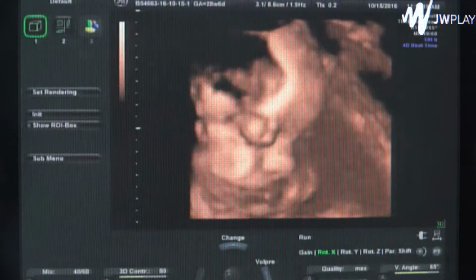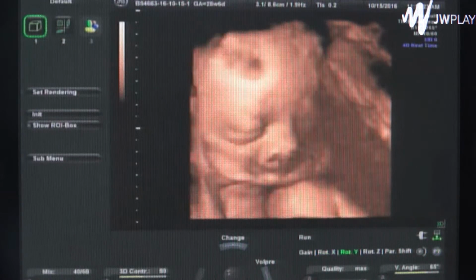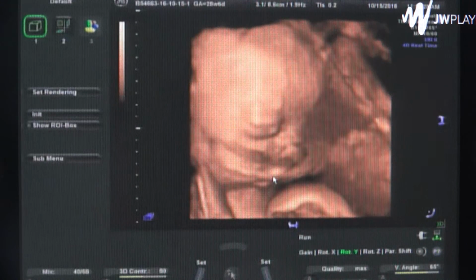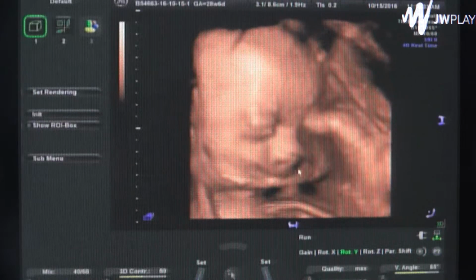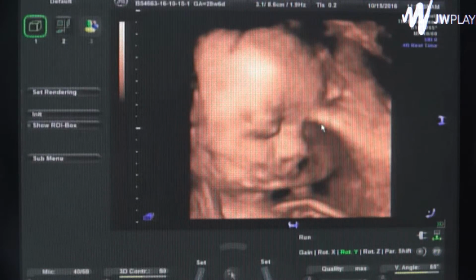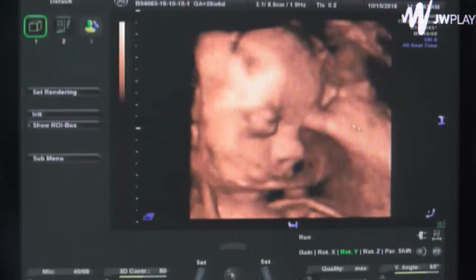Oh, that was kicking. Oh, there's her foot. Oh my goodness, she has her foot. Oh my gosh, she's like, oh. Can you see her nose? The umbilical cord's going across her face right here. It's normal for it to be near her face. It's not an issue. But it does kind of get in the way of our pictures. Do you see how that happens? Yeah. See her little nose and eye. But did you see that whole foot come up? Uh-huh. And then that's her foot right there too. Yeah, that's her toe. Oh my gosh, that's her big toe. This is like the bottom of her foot.